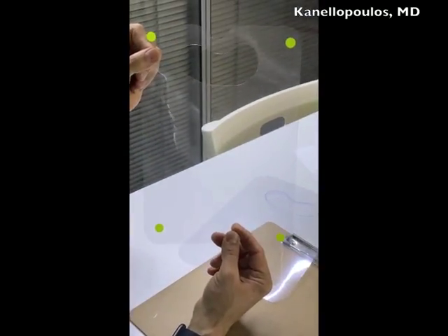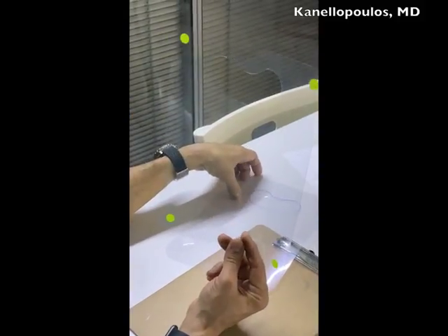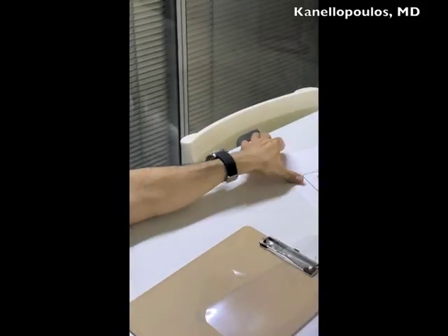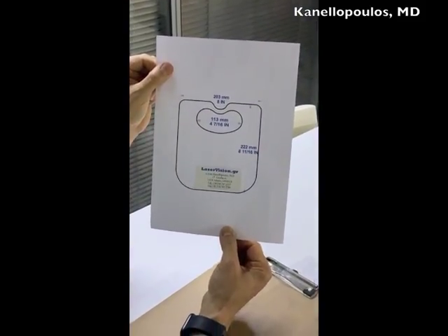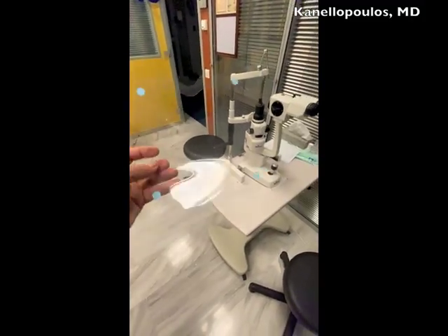And I showed to you before how we can actually place this in almost every slit lamp. This is a universal cover. Again, these are the dimensions, and I'll add these as a JPEG in the presentation. Thanks so much. Okay, so here's our ready product.